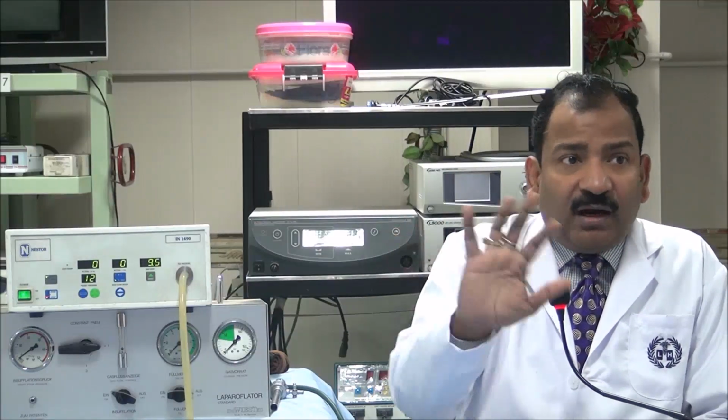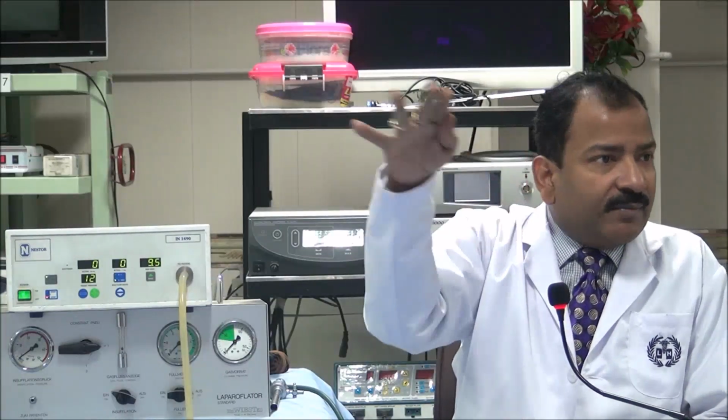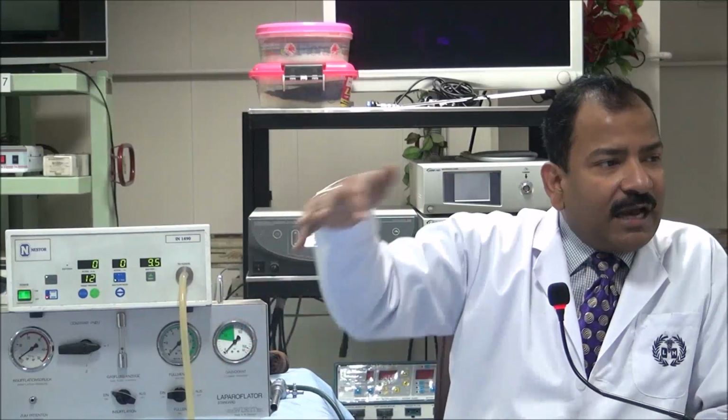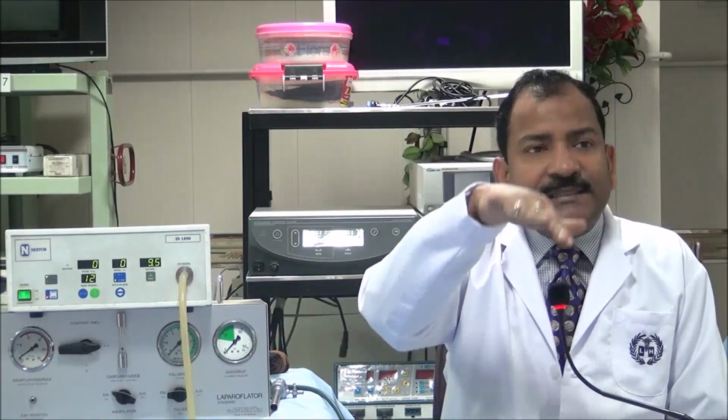So by default it is not a potential cavity. You have to break those fibrous trabeculae and then, just like this glove, it will stretch. But as soon as it is stretched, immediately the actual pressure will reach the preset pressure of 12. And still a little flow is there. Why? Actually it is detaching by the side.